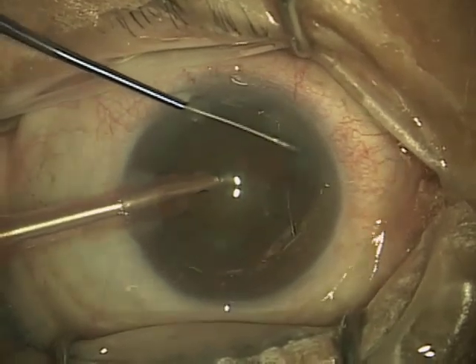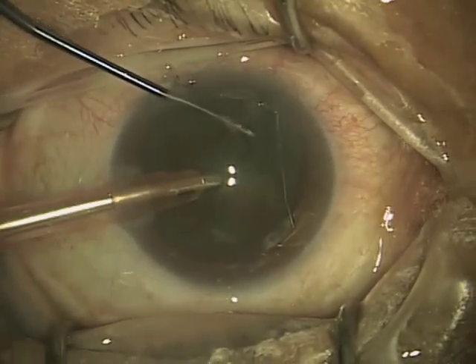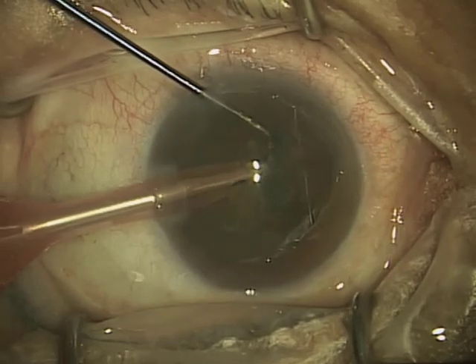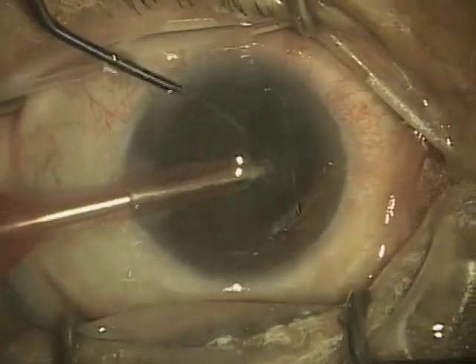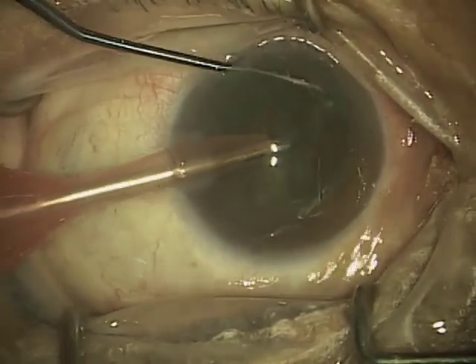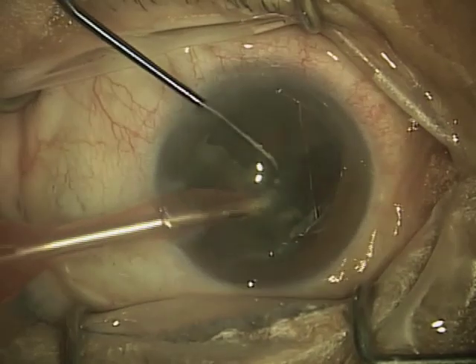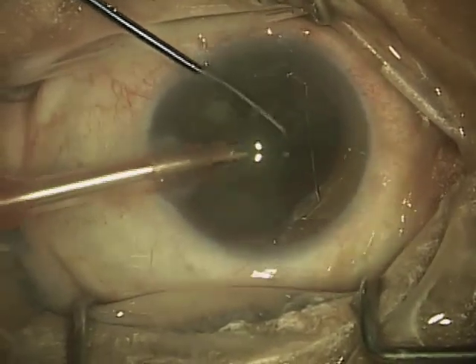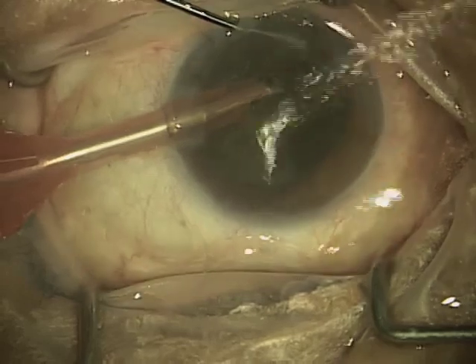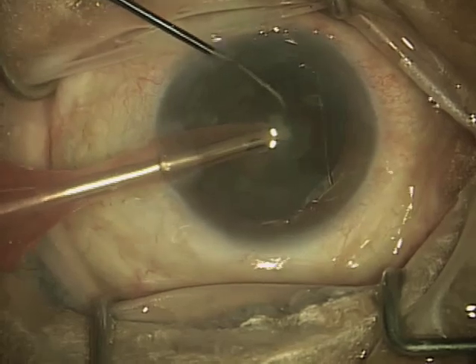I use a technique called horizontal chopping, where I use a second instrument — that's the titanium instrument you see at the top of the screen. That instrument allows me to move the cataract and separate it into fragments, which I then lead toward the phacoemulsification tip. The tip emulsifies those fragments, essentially cutting them up into tiny little pieces, and then they're vacuumed out through that very tip.